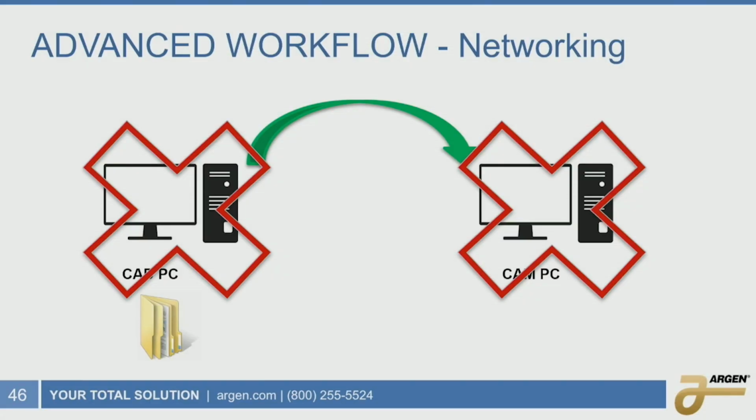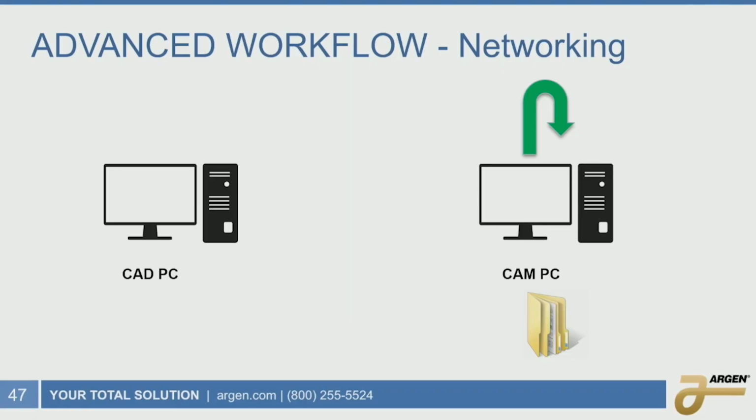The issue with that is that if your CAD PC is not on, or it is not working, or there is an issue with the networking, you can't access those files. So what you end up having to do is put your STLs onto a thumb drive and then transfer them over. So what I'm going to show you here is the way that I like to do my networking.